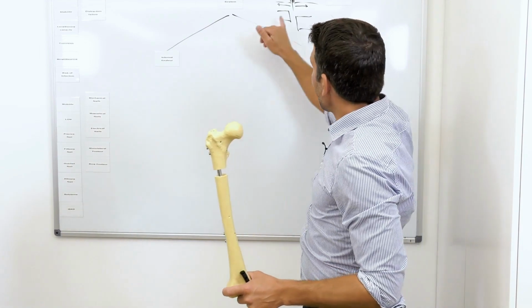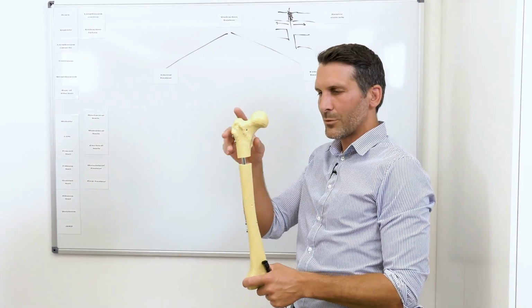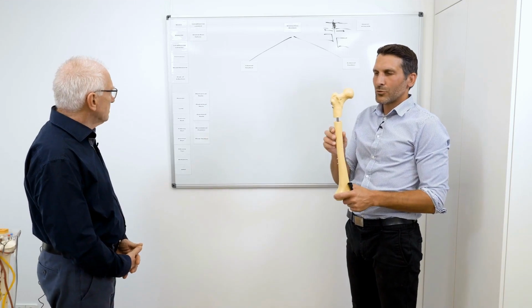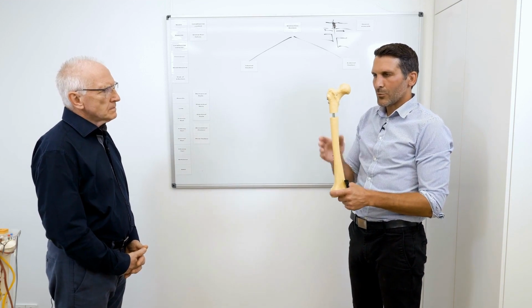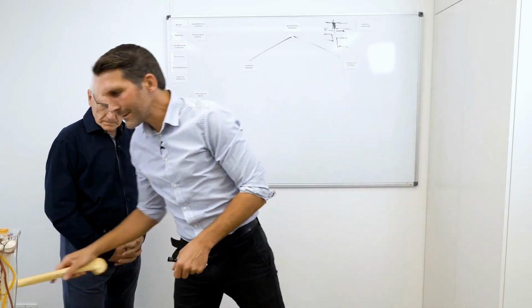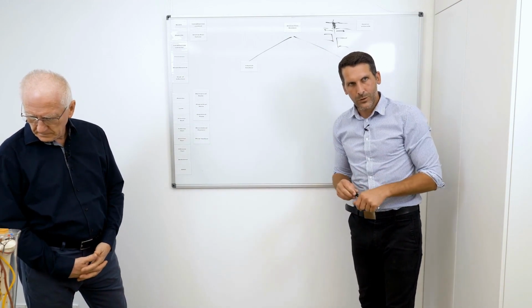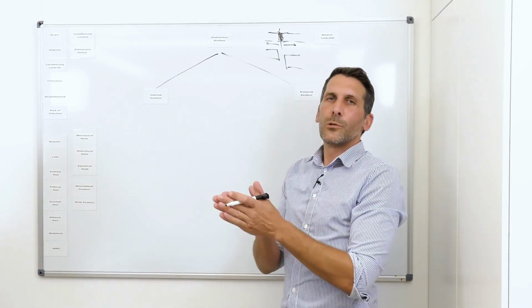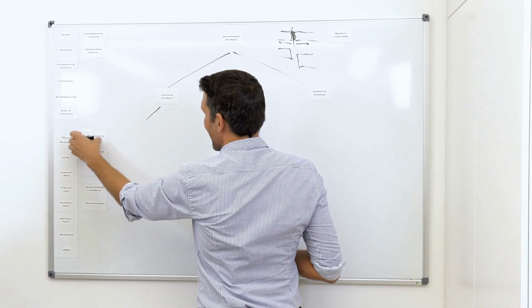Basically, the principle here is to ensure that a so-called dislocation, a shift of the fracture ends or bone ends, is avoided with a so-called internal fixator. This is nothing other than a so-called nail system that is inserted into the bone, blocked by two screws, one at the top and one at the bottom, and thus stabilizes the bone. With this nail system, you can now distinguish, especially in the area of distraction, between the mechanism by which the nail system performs the distraction. That means we can distinguish our nails, the internal fixators, into purely mechanical nails.